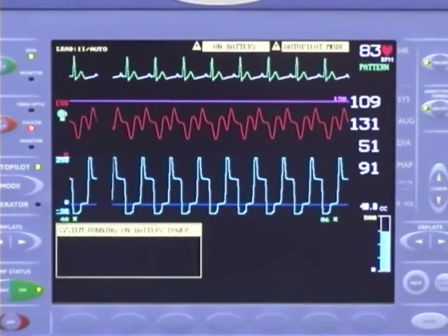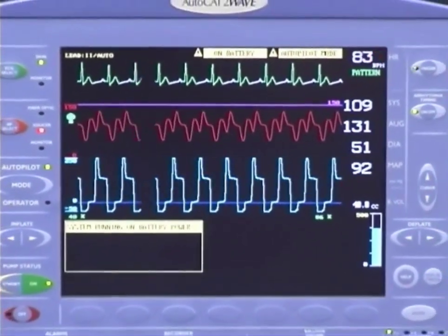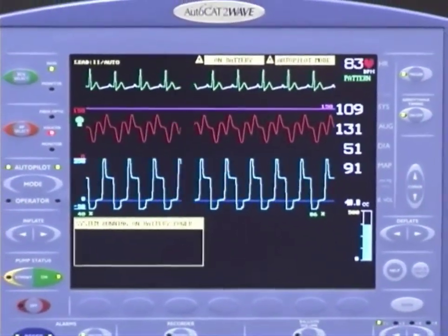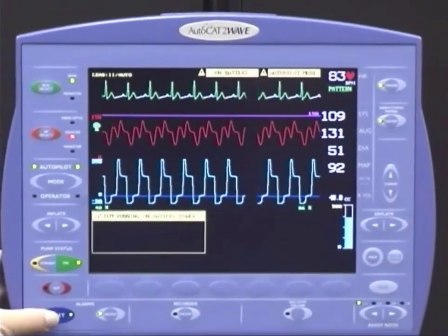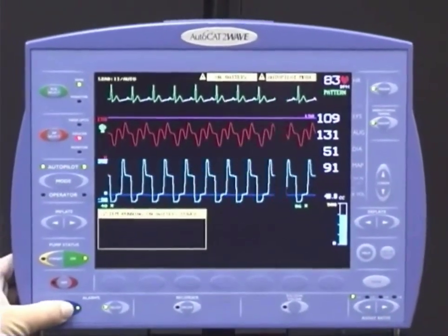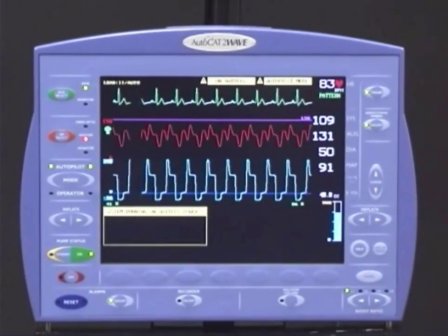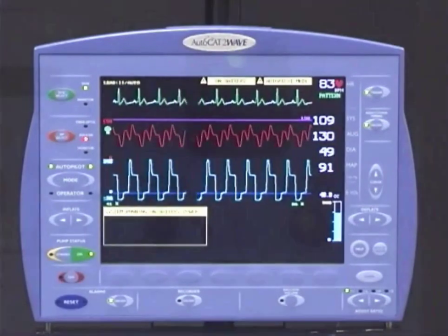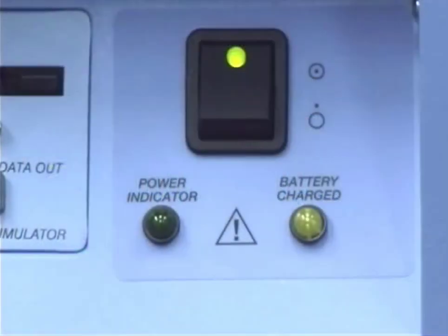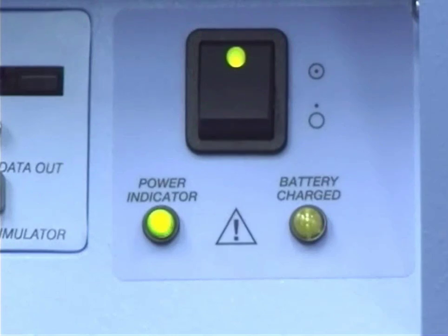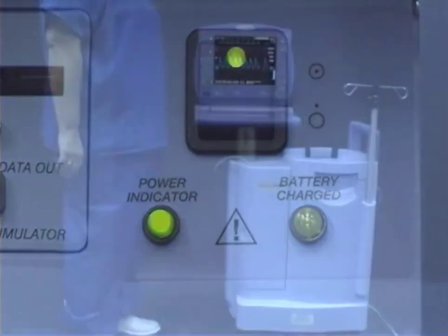An alarm will sound when the pump first switches over to battery power to alert you. Alerts will sound when less than 20, 10, and 5 minutes of battery time remain. The pump should be plugged into an AC power outlet whenever possible to maintain full charge of the battery.